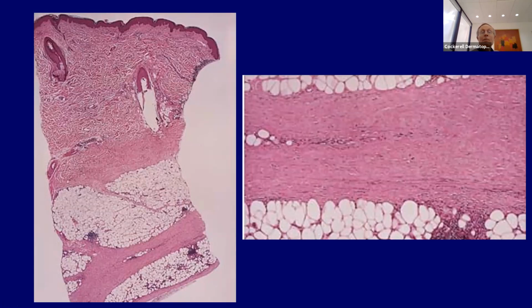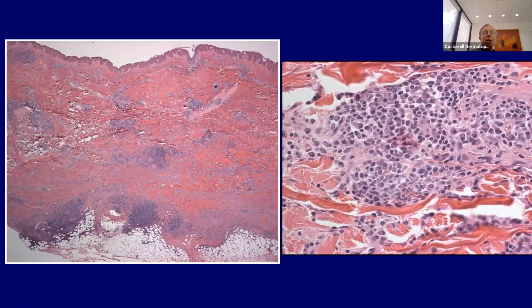So this is an example of scleroderma panniculitis. This is one that's a little bit earlier, still in an inflammatory stage. And if you get scleroderma panniculitis super early, really, really early, you'll see mostly edema of the septa, the collagen thickened with edematous, kind of a puffy myxoid appearance. That's what you see before you get much inflammation or you get the sclerosis. But here you get a lot of lymphocytes and plasma cells.